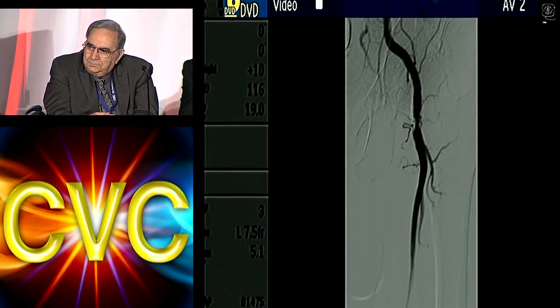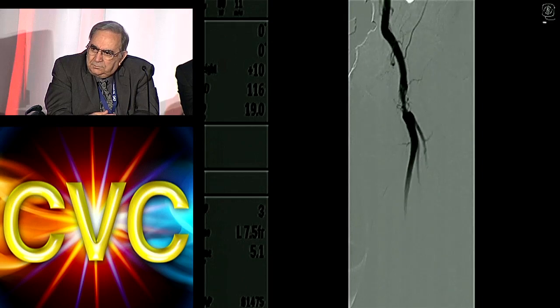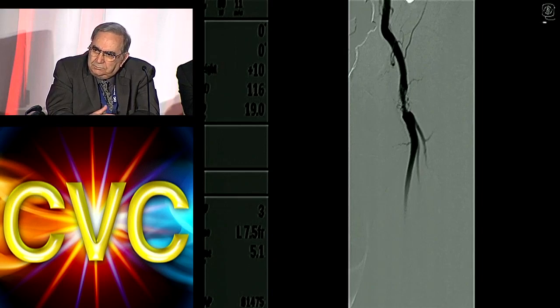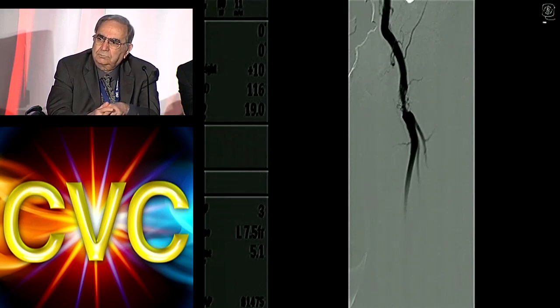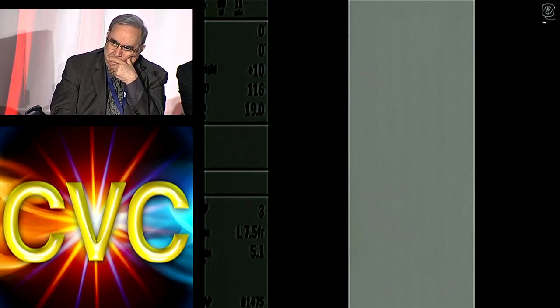So this common femoral, you can turn the lights back down, has kind of an interesting lesion there. It doesn't look too bad, but I was worried that things were worse than this. We did IVUS it, and we got about maybe a 40-45% diameter stenosis by diameter. So we did do a quick pressure gradient. There was absolutely no pressure gradient across it. I think the reason is that the native vessels are big. They're like 8.5, 8.8. And we got almost 5 millimeter lumen within that lesion. So I don't think the common femoral is significant, but I welcome you guys' input.